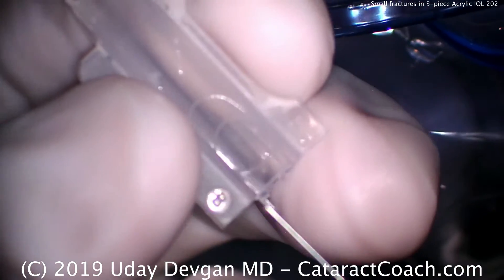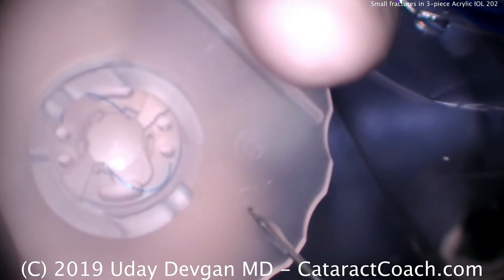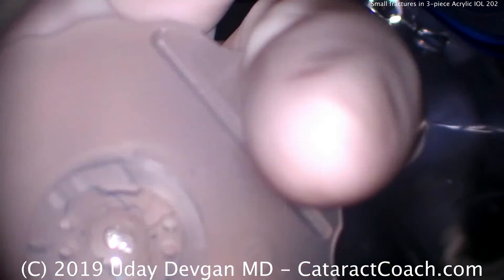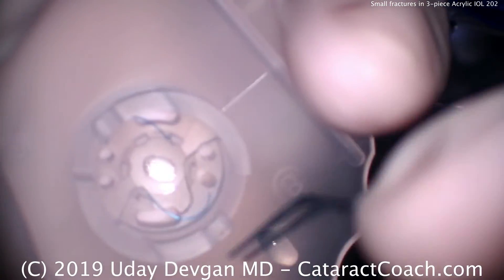Here's the cartridge. It's a B cartridge, and you see it has a little peg at the end. That peg is to help hold the haptic of this three-piece lens. There's the three-piece lens — it looks fine. We'll grab that lens and we're going to load it up.